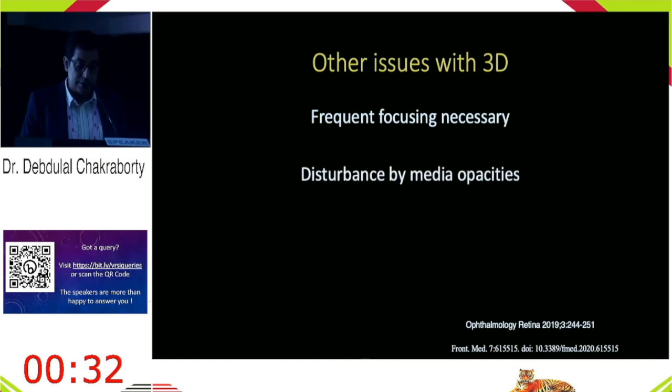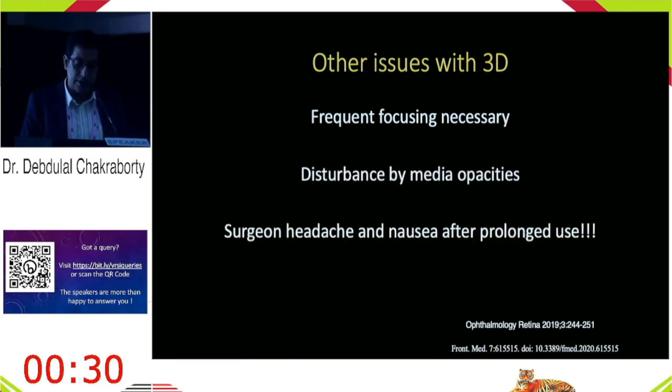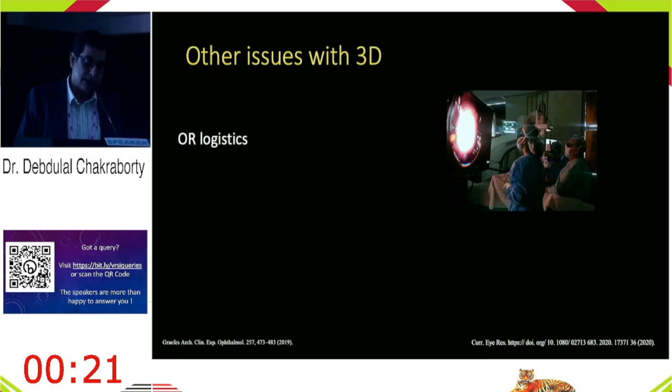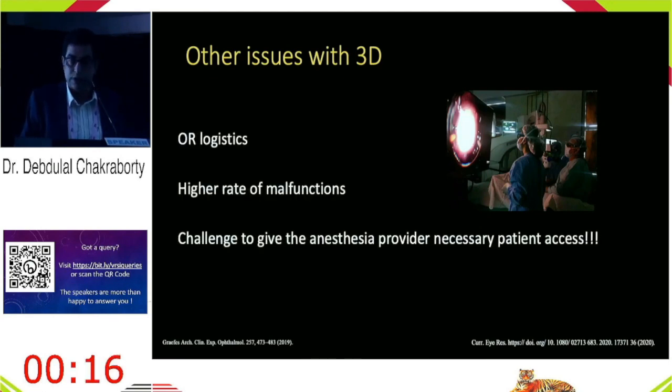Frequent focusing is necessary. Disturbance by media opacities. Surgeon has headache and nausea at the end of the day. I've had that personally. Surgeons making slower and more conservative movements. There are still other issues. OR logistics go for a toss, higher rate of malfunctions, challenge to give the anesthesia provider necessary patient access.